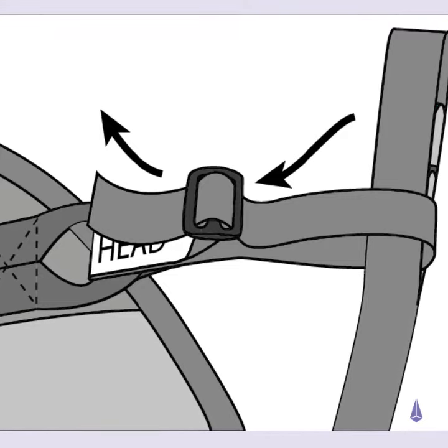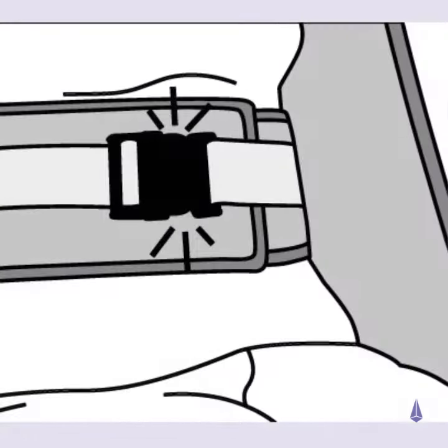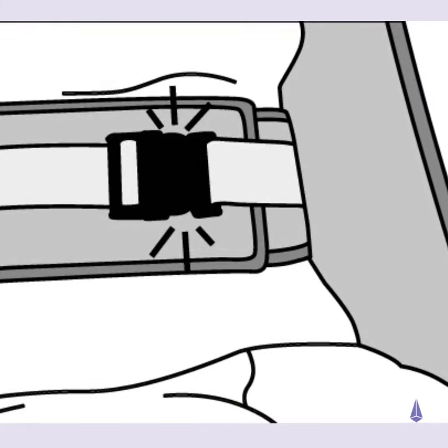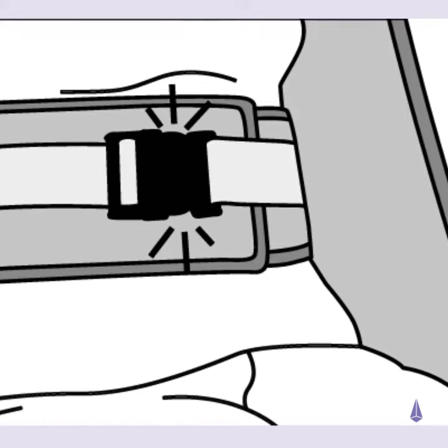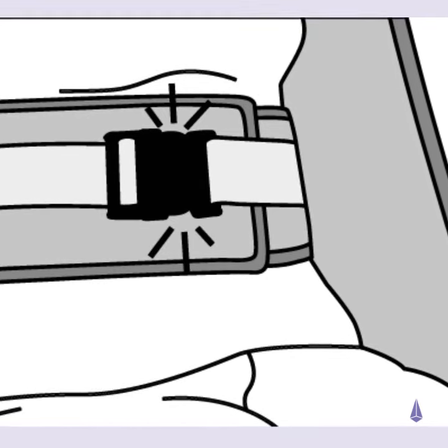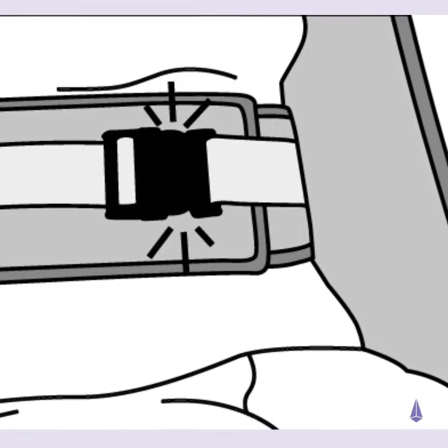Attach your shoulder tape securely to the hoist. If waist or chest support is fitted, ensure that it is secured around the patient prior to the start of the transfer. Fasten the clunk click buckle and adjust firmly using the webbing strap.